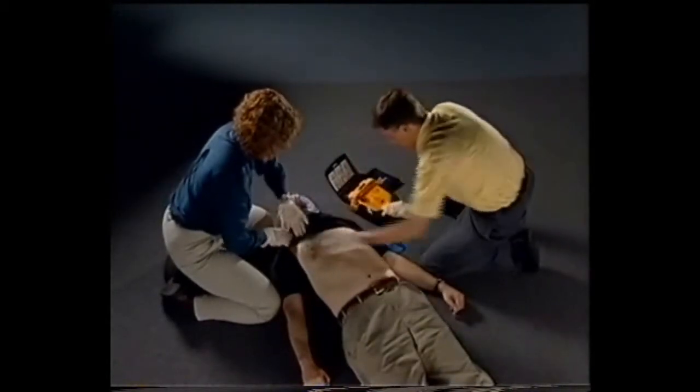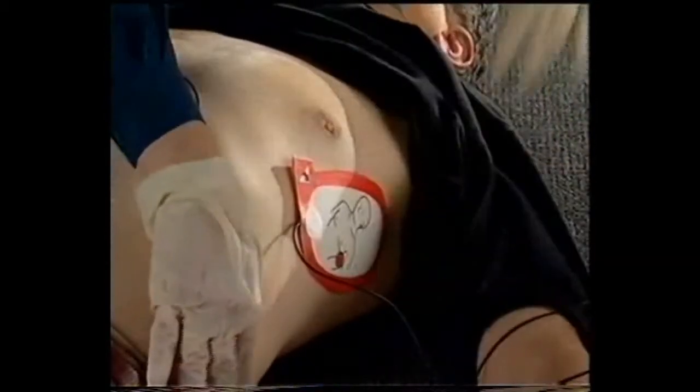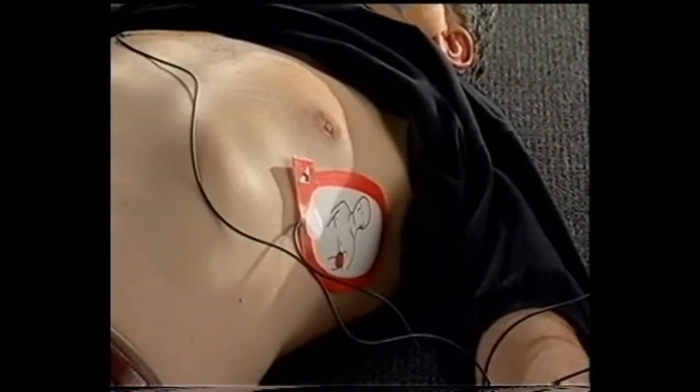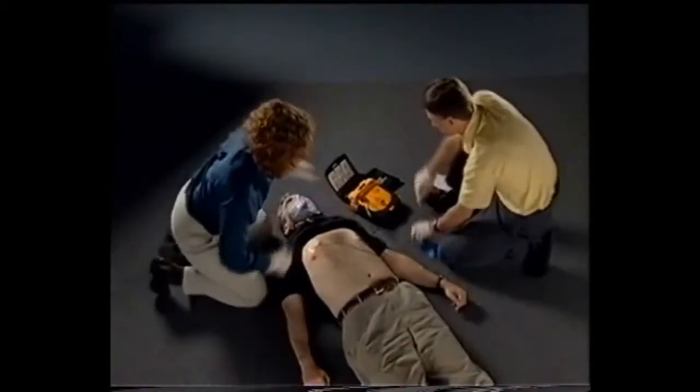Press each pad on the chest firmly. The other pad goes on the other side of the chest, outside the left nipple, below the armpit. Once the electrode pads are firmly on the chest, the pad indicator lights turn from red to green, and the defibrillator says, "Do not touch patient."